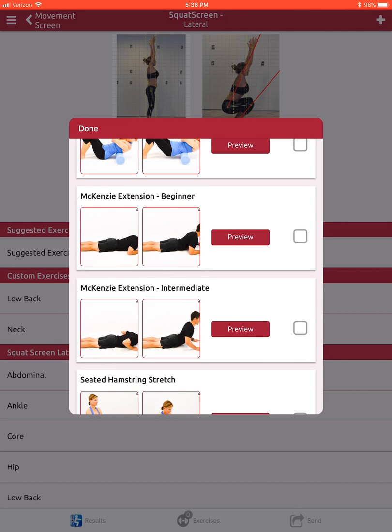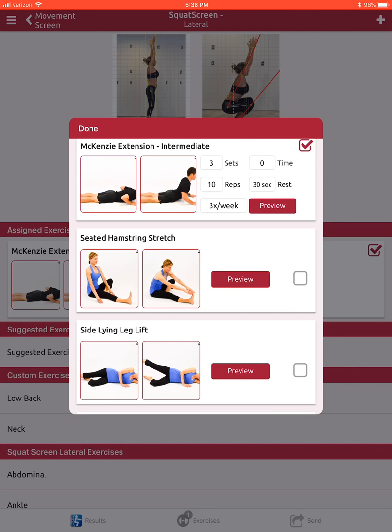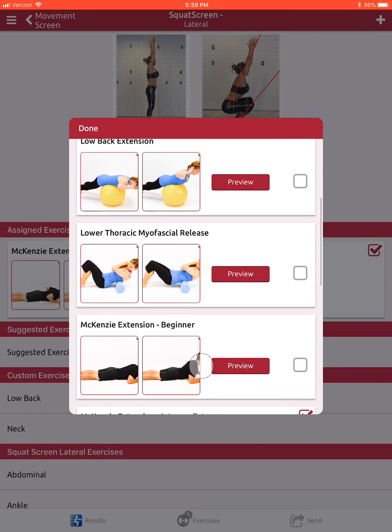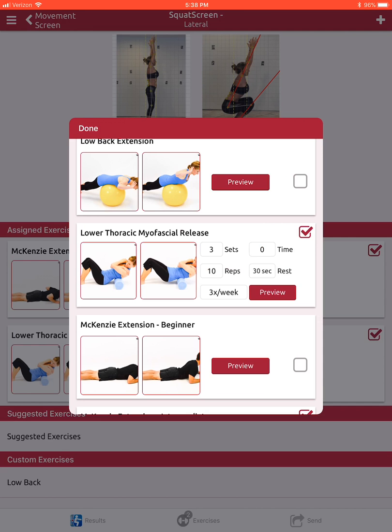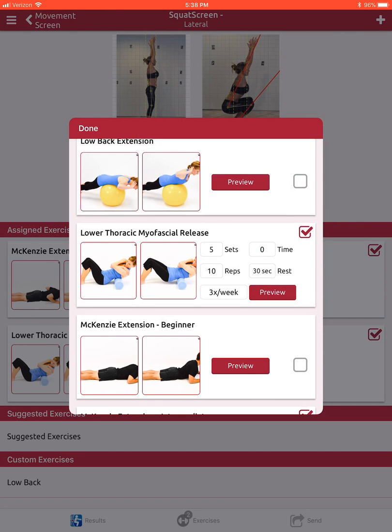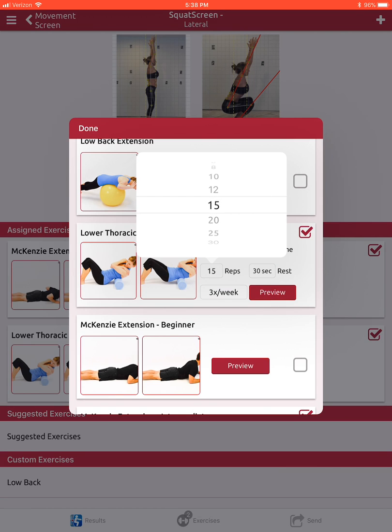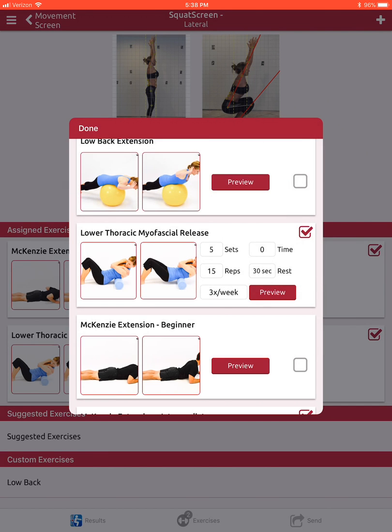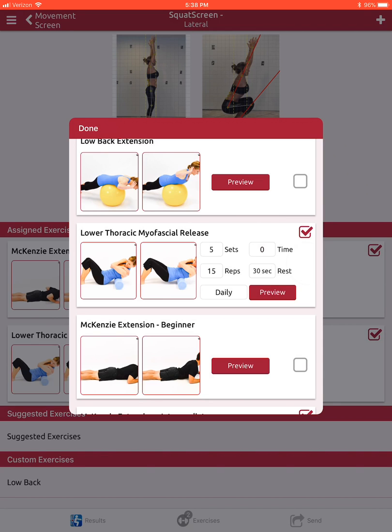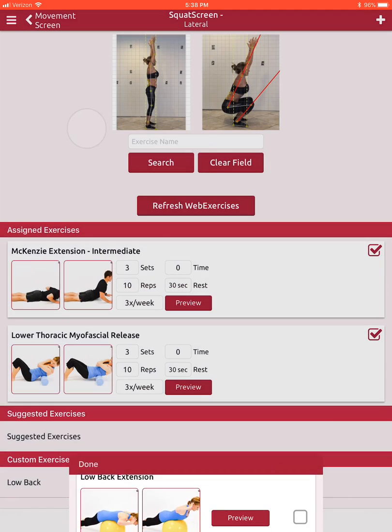We'll go ahead and select a foam rolling exercise, and of course we can change sets, change reps if we want to, and I'll go ahead and make this one daily as well. Based on this, I'm going to go ahead and click done.